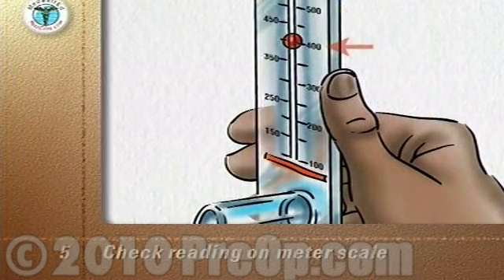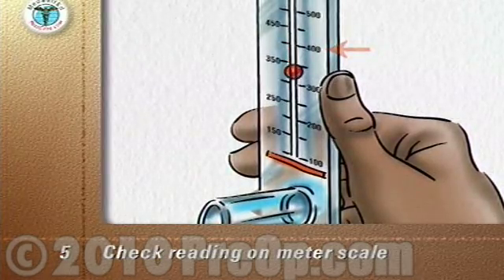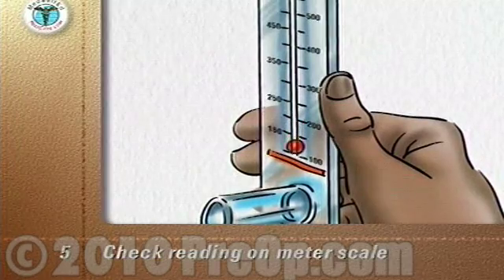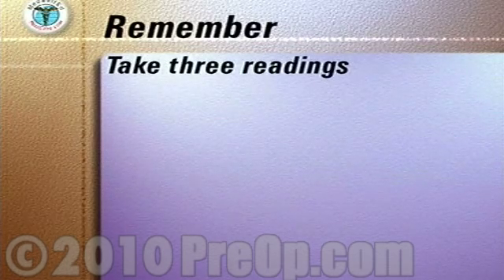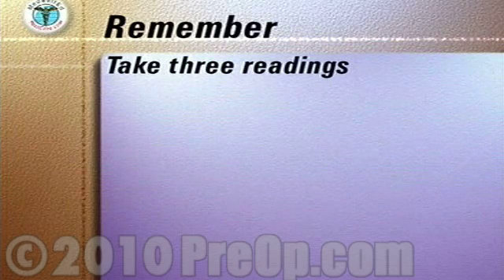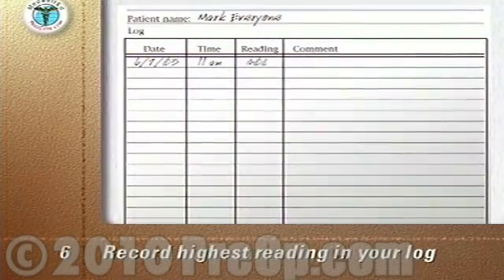Check the reading on the meter scale — in this case 400 liters per minute — and write it down. Move the marker back to zero. Repeat the entire routine two more times for a total of three times. The three readings you get should be close together.